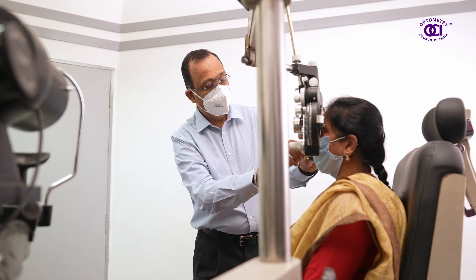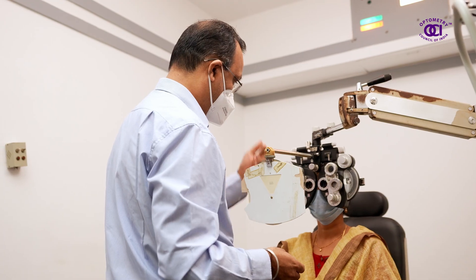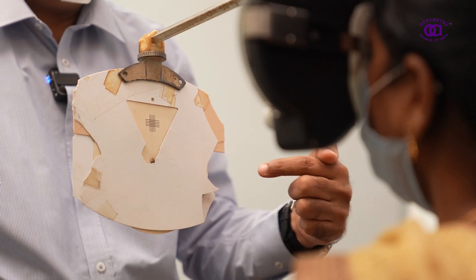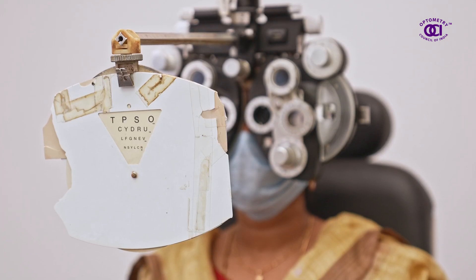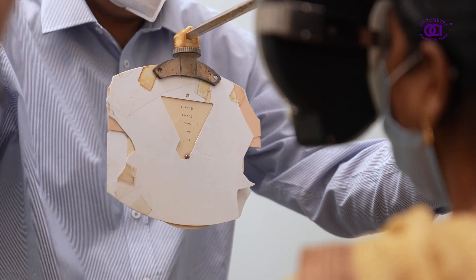Checking for any spectacle power is done using equipment such as the retinoscope. Following the same, the optometrist checks your vision with the spectacle power in place and arrives at an end point where your vision as well as comfort of spectacle power is recorded.